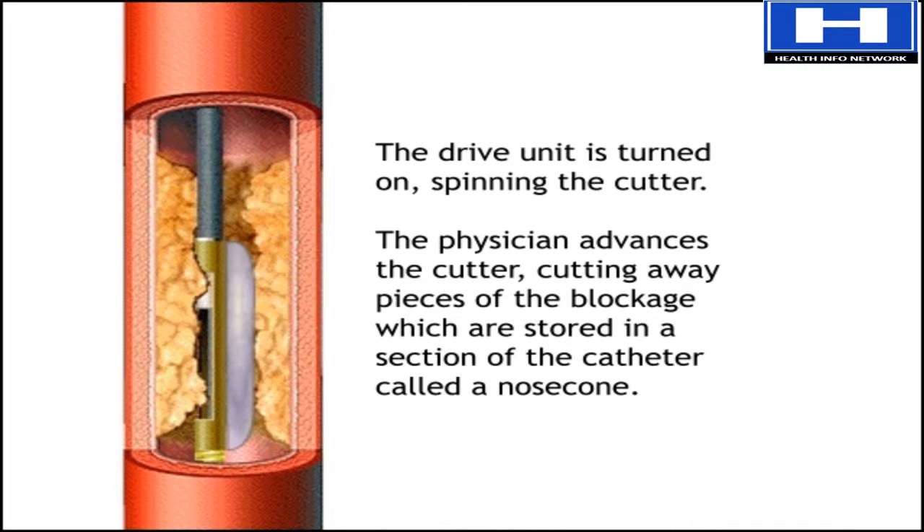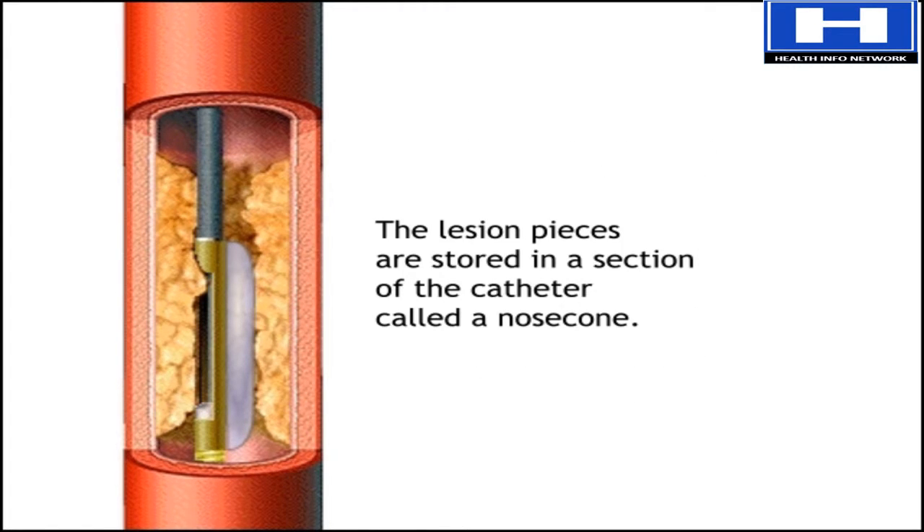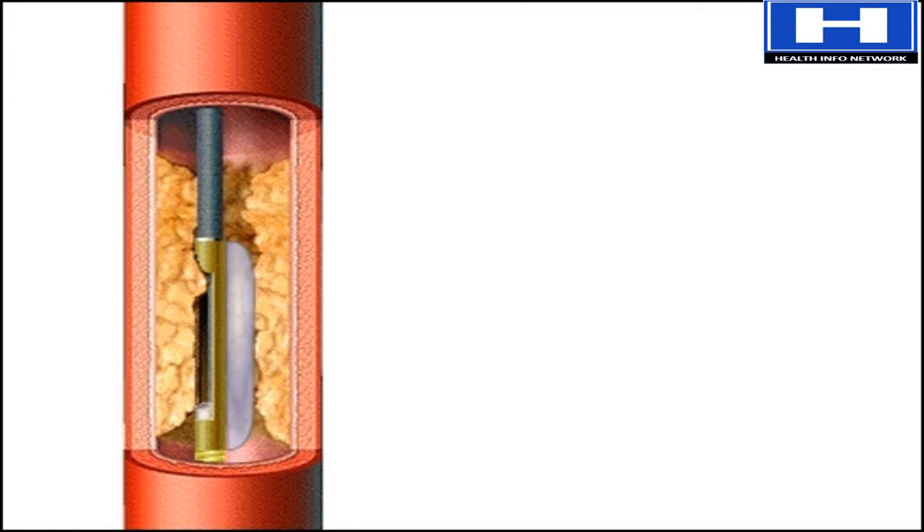A drive unit is turned on, causing the cutter to spin. The doctor advances a lever on the drive unit that in turn advances the cutter. The pieces of blockage it cuts away are stored in a section of the catheter called a nose cone, until they are removed at the end of the procedure.